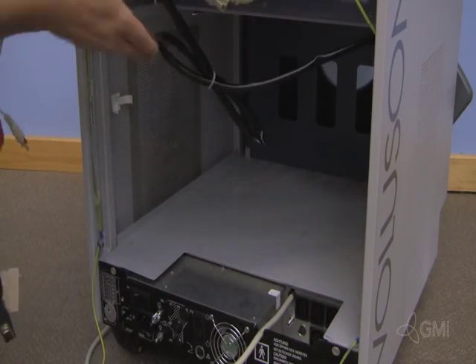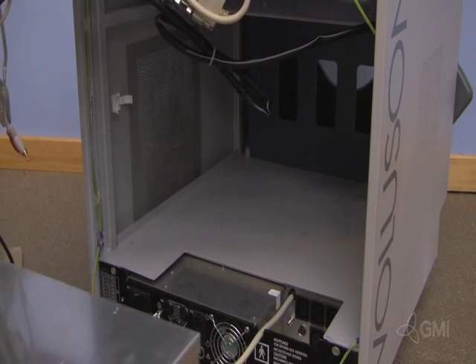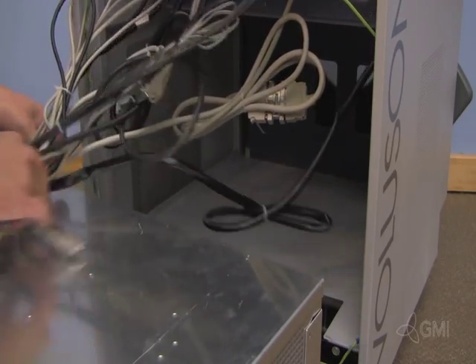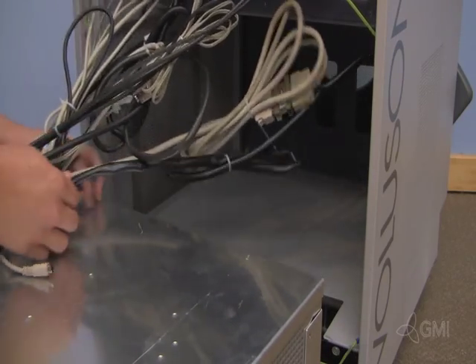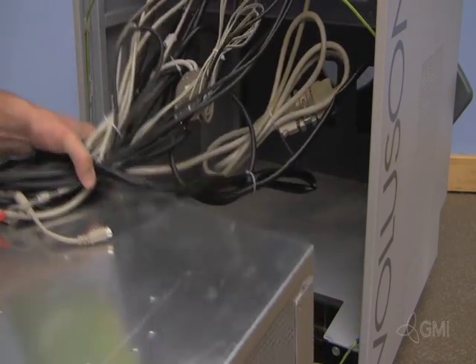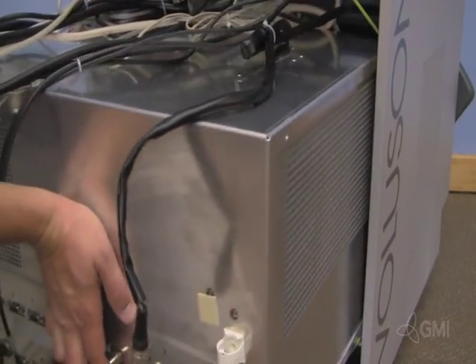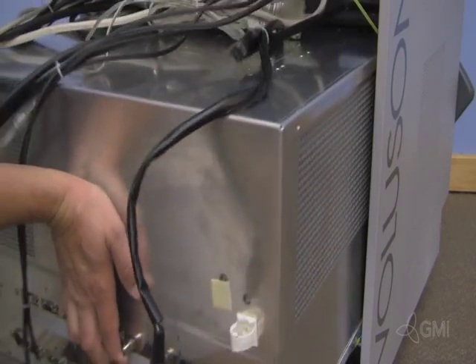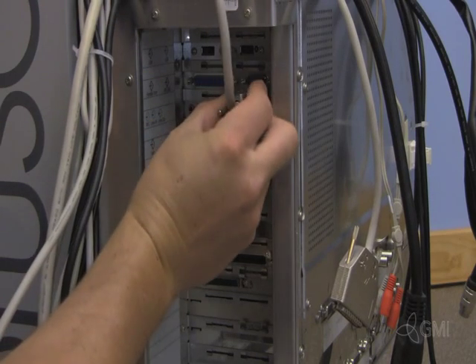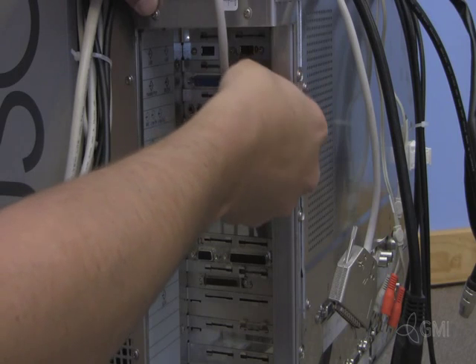Hold the cables out of the way. Reinstall the e-box into the chassis. Be careful not to crush any cables. Make sure to leave the e-box out about 8 inches. Plug in all cables to the BEP, making sure USB cables are plugged into the correct ports.